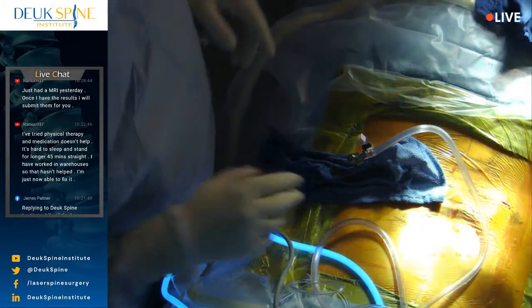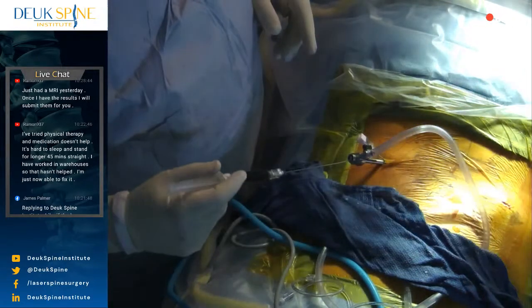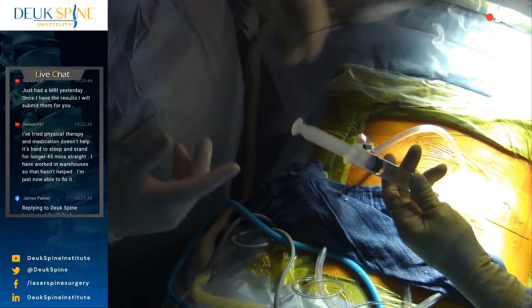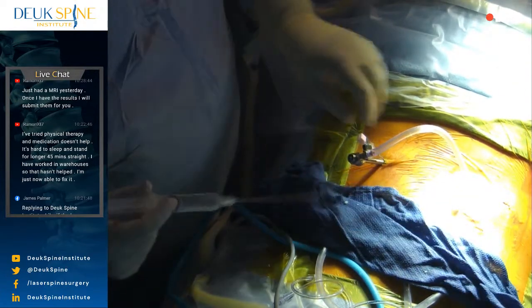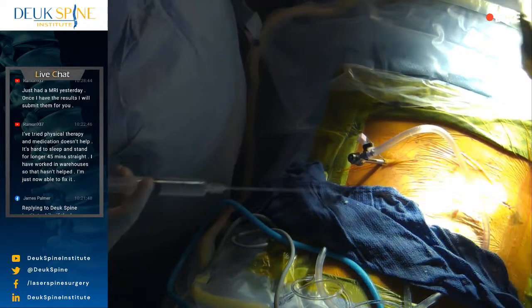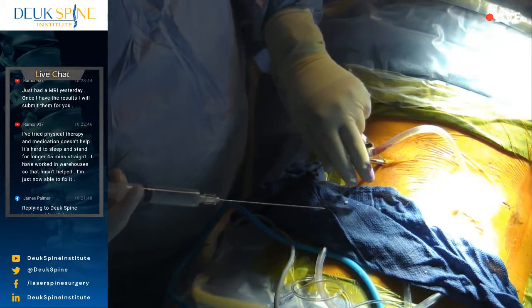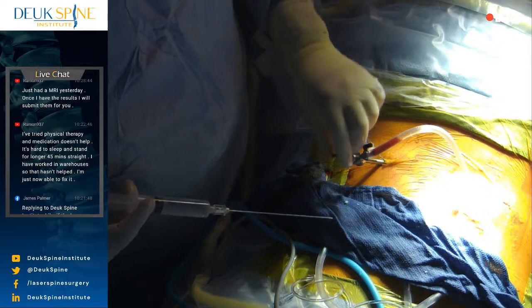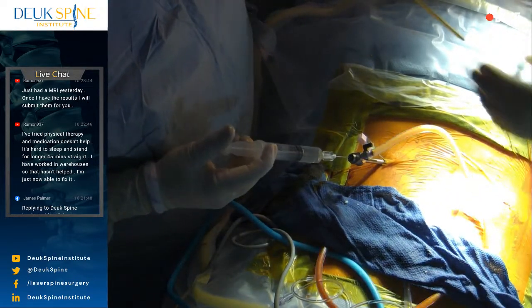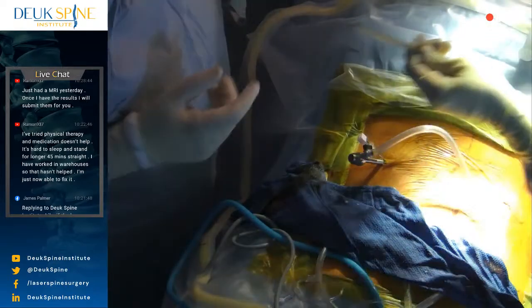Okie dokie, artichoke. Let's get that betadine, the stuff that NASA developed. All right, let's have that. We've done 2 discs. We've repaired 2. We're getting ready to finish up with number L3-4. Maybe a little more irrigation.